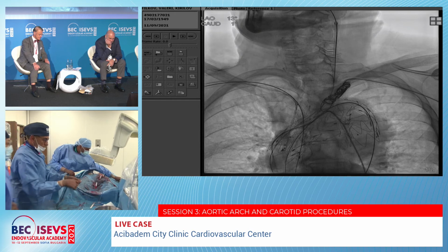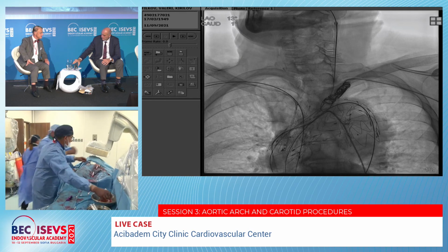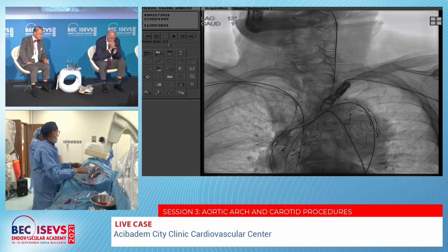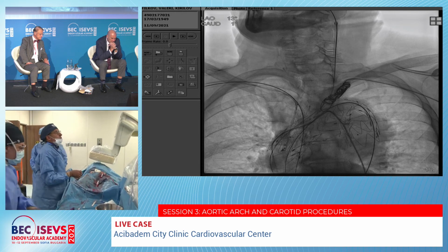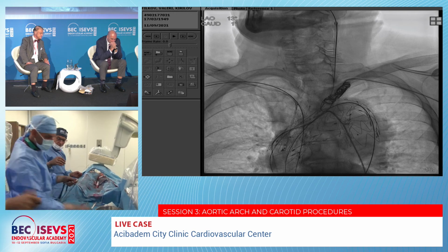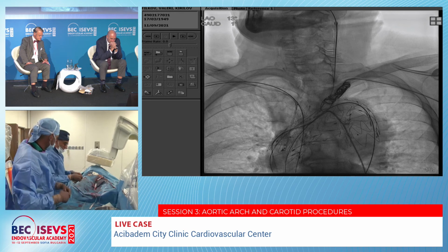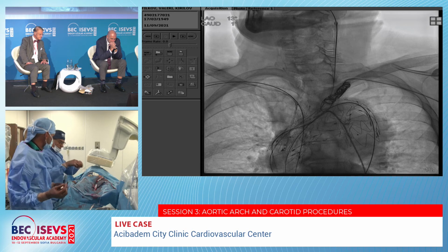That was a guide wire. You brought in a guide wire now. Super. Okay, we are going to utilize now a long pigtail in order to have longer than the guiding catheter. We are using a 6 French guiding catheter, right Judkins guiding catheter.